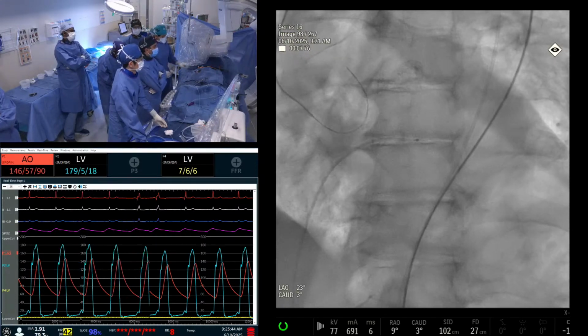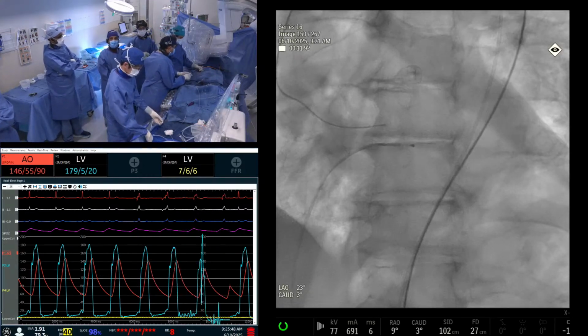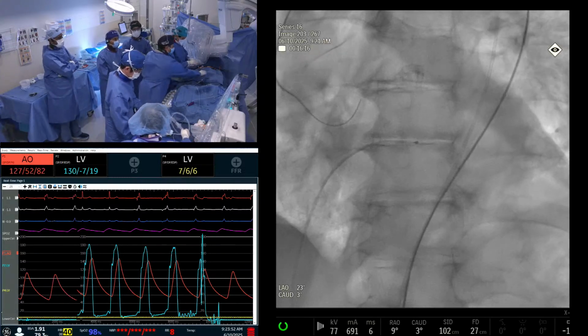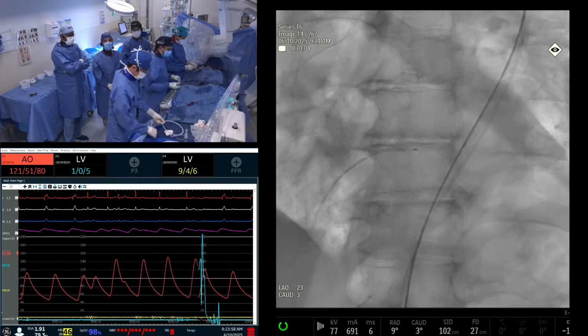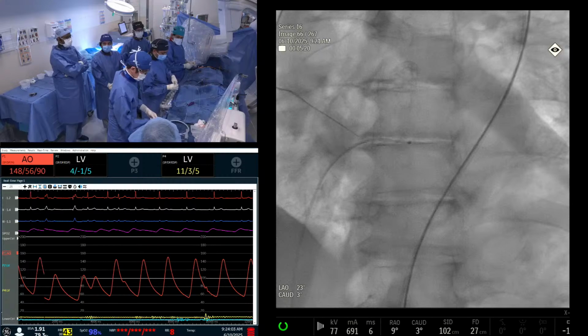Okay, we have that. Good. Let's start. There's also moderate aortic insufficiency, because that's known from the baseline. We are going to do a BAV also, a small one, not an aggressive one because of the AR. And we did the live echo, right? Yes, and Stan already showed the moderate AR on the echo beautifully on the long axis.